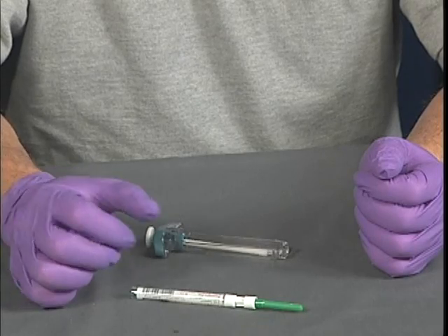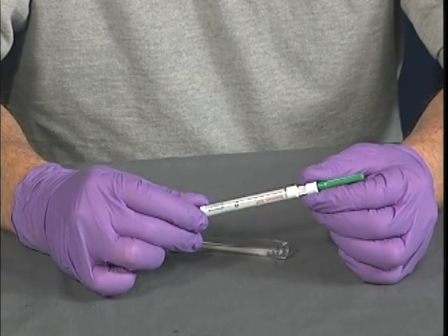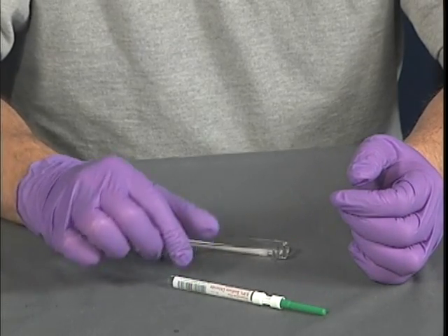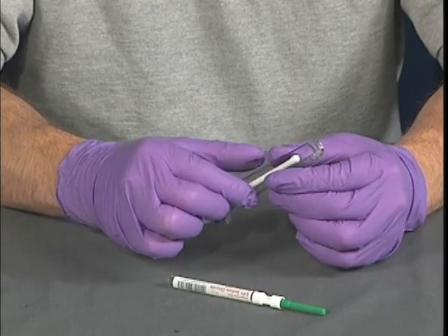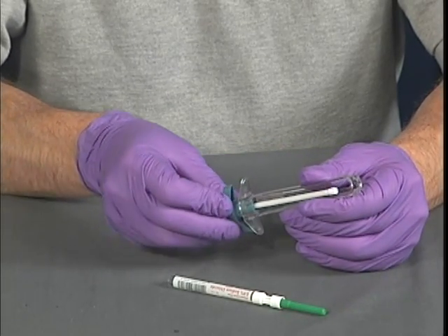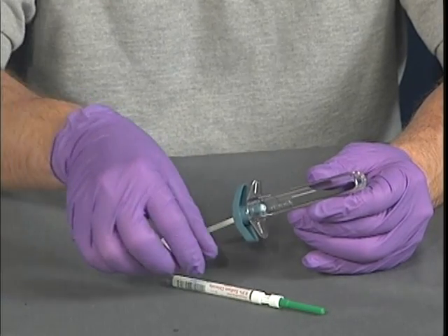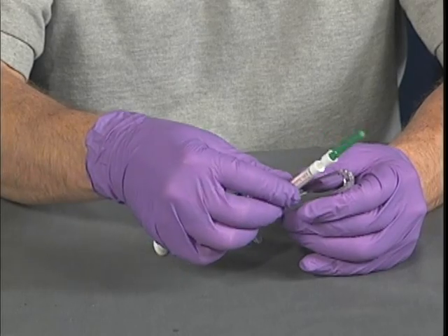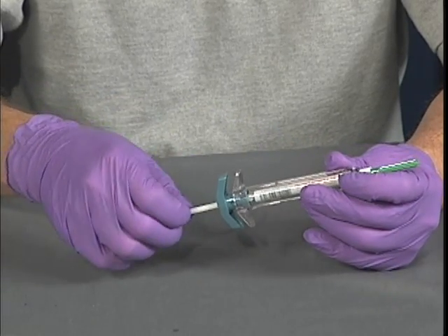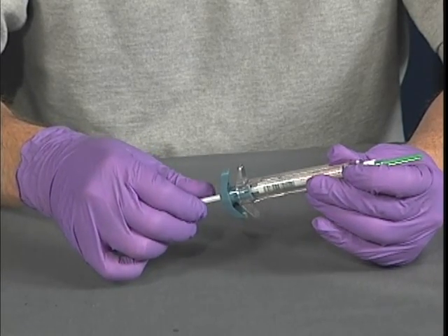Inspect the medication cartridge to verify the right medication, the right dose, the right expiration date, the right route, and the right patient. Insert and secure the syringe cartridge into the cartridge holder following the manufacturer's directions. This style of Carpuject involves threading the plunger onto the medication unit, then locking it in place.